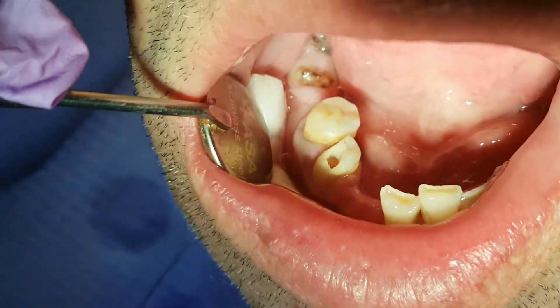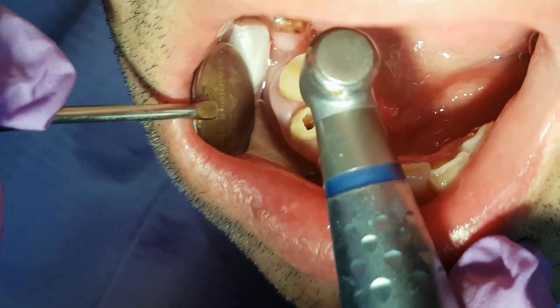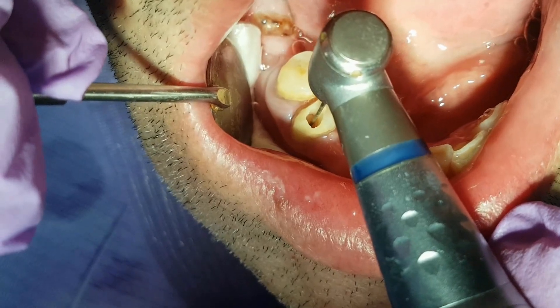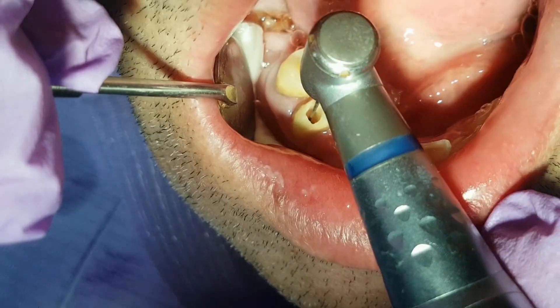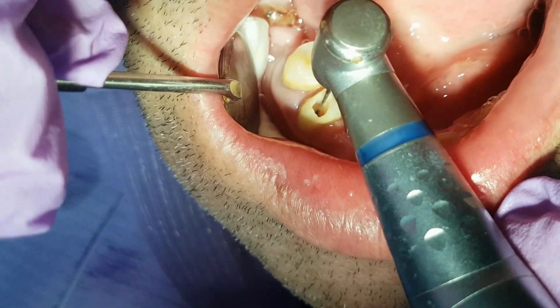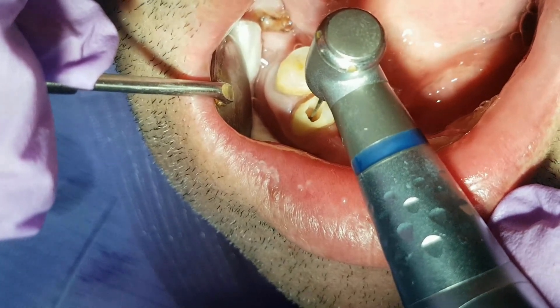We take out the nerve — this ends the extirpation phase of the nerve tissue. Now we use an instrument to shape the root canals so we can fill them with a definitive filling in the next session. We can do this using hand instruments, but in this case we use machine instruments.